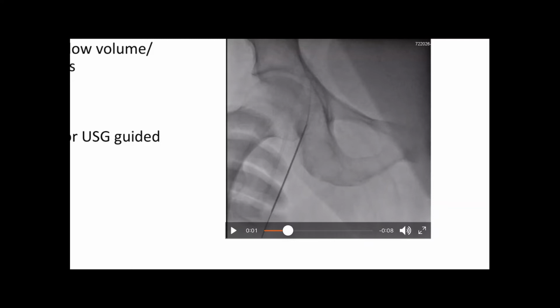So that can also create trouble. So what I practice and recommend is that you should first take a venous access and put in a wire inside. If there is any ooze, it will be very minimal. You then proceed to take the arterial access, put a sheath in the artery, and then follow it with a sheath in the vein. So this is the sequence that I recommend.